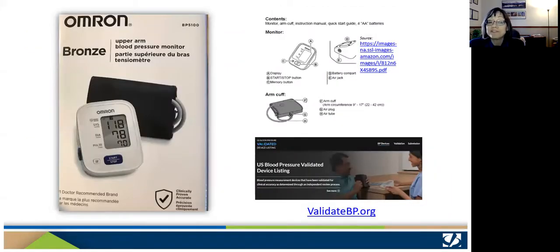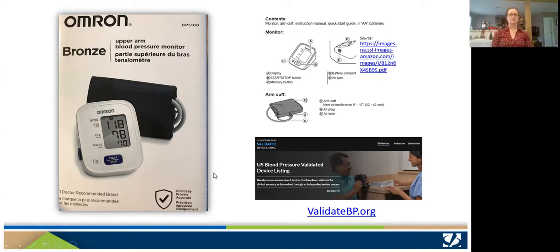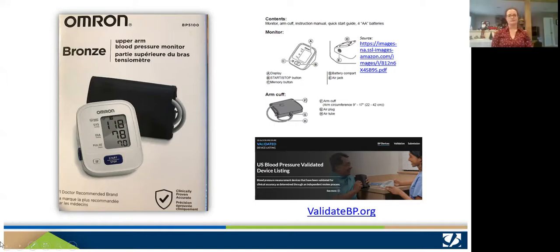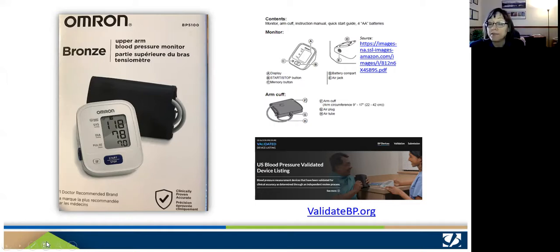As we said, you should have received your blood pressure monitors. They probably look something like this. And they all should have an instruction manual, but in case you had to refer to it, you can link to it over there. And also if you have questions about, is this device validated? Of course, you want your patients to use a validated device. Our Omron devices are validated, but the list tends to change with time. So if you get questions about it or you're just wondering, you can go to this website down here at the bottom, validatebp.org, and check.